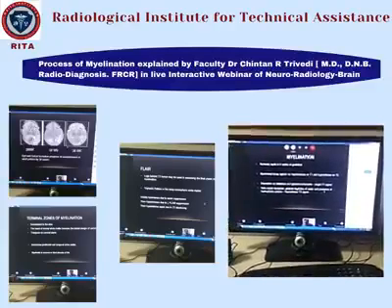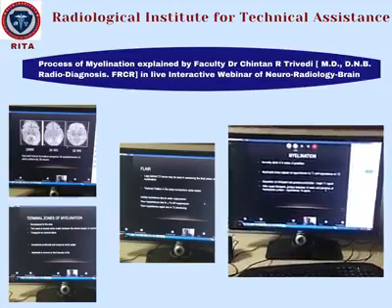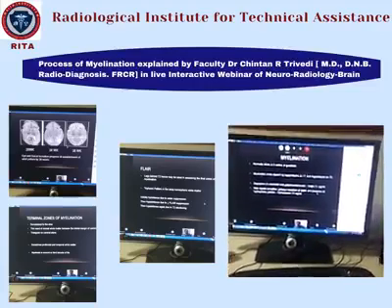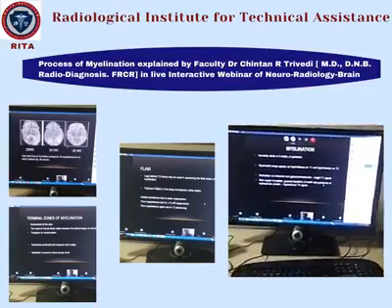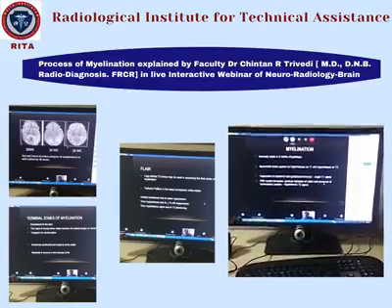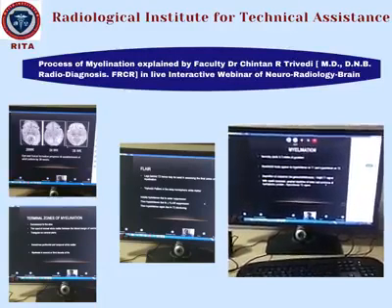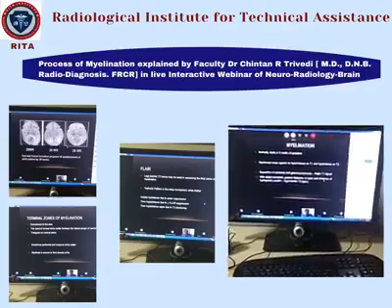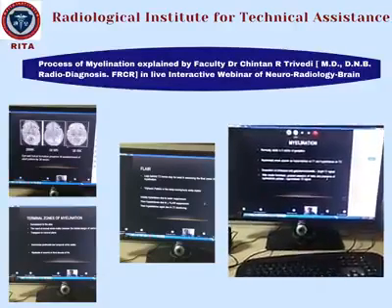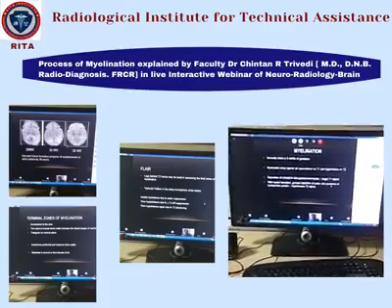So that white bright signal is because of the myelin, and so it appears hyperintense on T1 and hypointense on T2. So on T2 the grey matter is white and white matter is black. That's the opposite, right? Because of the lipids and all, the fluid reduces, and that's why the T2 signal reduces. So as there is myelin formation, the presence of the hydrophobic protein and the depletion of fluid causes a hypointensity in the T2 signal.